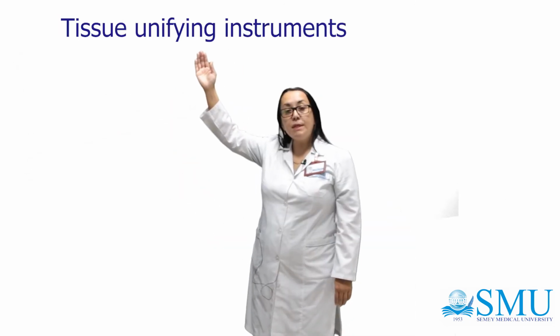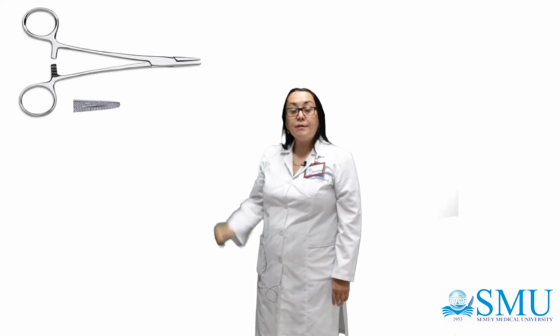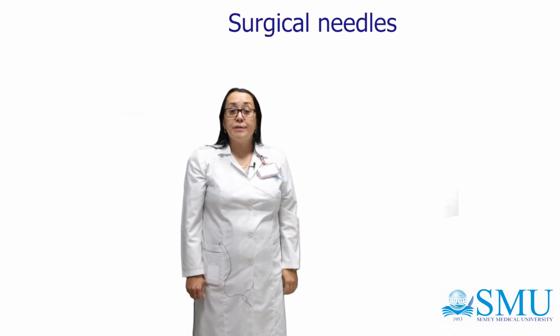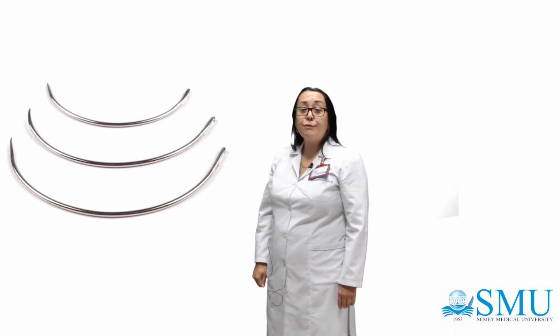Tissue unifying instruments. Needle holders. Hegar's needle holder and Matthieu needle holder. Surgical needles. Curved needles are classified as tapered, most commonly used in soft tissue such as intestine, and also for vascular and nerve suturing.